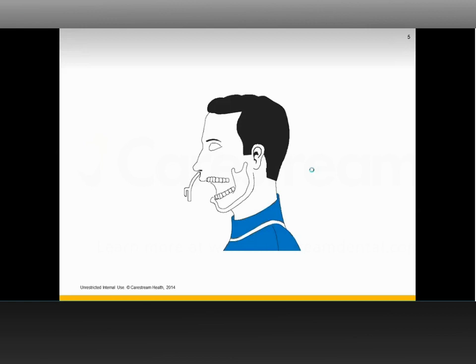How do you do that? Even though it's a short duration of time, you can use an intraoral bite block just to keep the patient's mouth open so that the patient can bite on it and avoid any kind of muscular spasms that could create motion artifacts. Motion artifacts are one of the major reasons why scans don't look good. And again, let me emphasize, the fast scan mode is the best way to go. When you keep the mouth open for as short a duration as you can and use the fast scan mode, you avoid most of the possibilities for capturing motion artifacts.